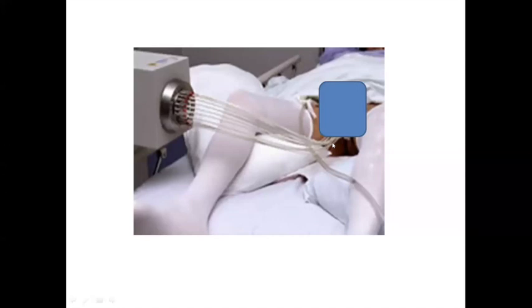And each time it goes into the prostate, it then loiters for a few seconds in different positions to emit the radiation in as accurate a way as possible, to deliver the dose of radiation deliberately straight into the prostate gland, but not into the bladder or the back passage or anything else. And therefore you're avoiding an awful lot of normal structures by doing it this way.